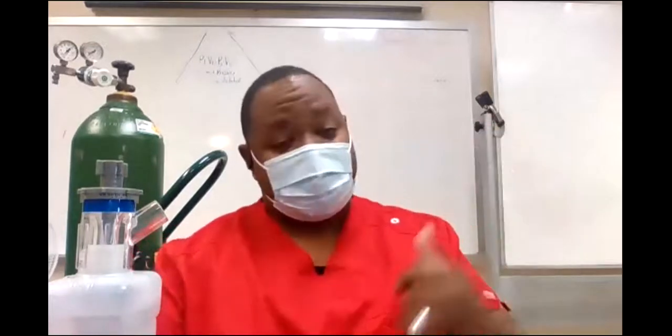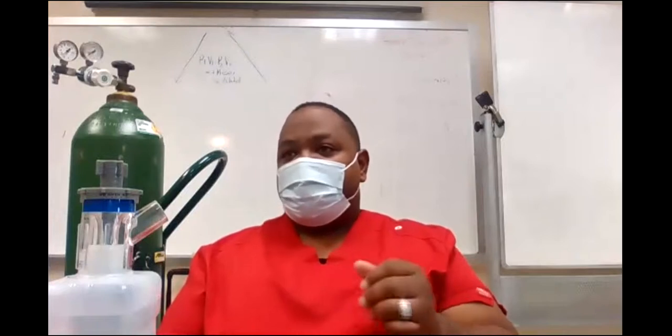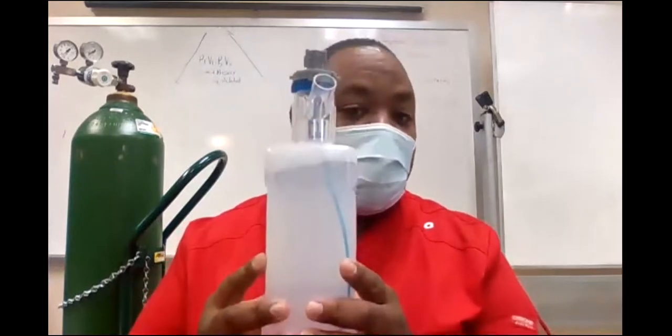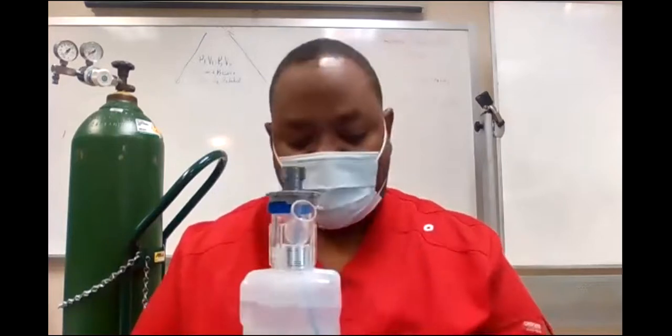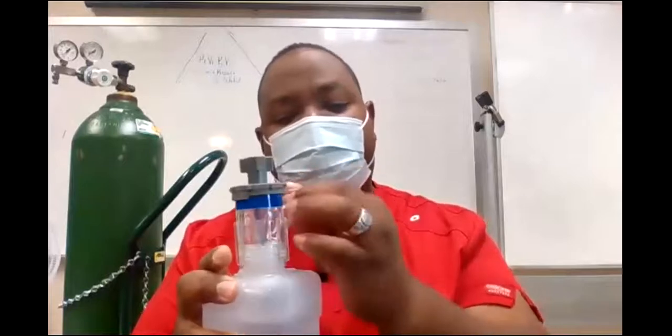Aerosol this, aerosol that. What I was showing y'all earlier when I was saying aerosol T-piece, aerosol trach collar, aerosol face tent, all right? Those are the different pieces that go on the end. So here it is. You first start with this bottle, called a large volume nebulizer, okay? This is a large volume because it has a lot of water in it, a lot of volume of water, okay? Large volume nebulizer that utilizes the Venturi and Bernoulli principle.